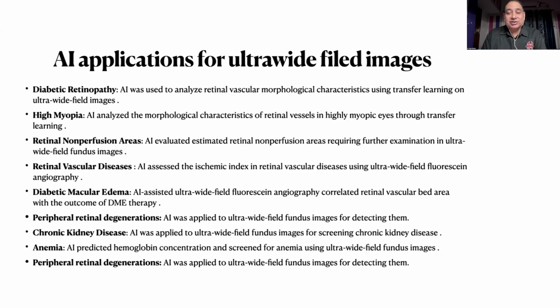The ischemic index, which at some time became not so popular, is again gaining more popularity in retinal vascular disease. We can quantify them using these ultra-wide field fundus fluorescein angiogram. In diabetic macular edema, there has been image processing work where they tried looking at the retinal vascular bed area and correlating it with the outcome of diabetic macular edema treatment.